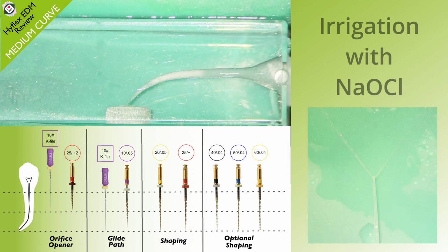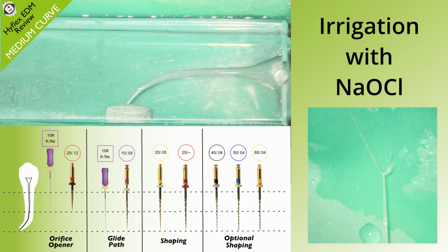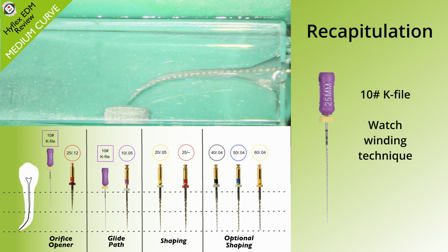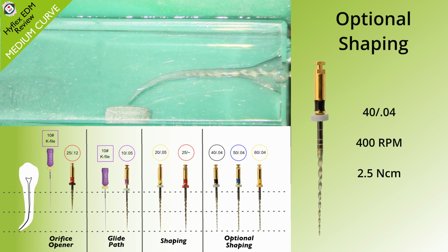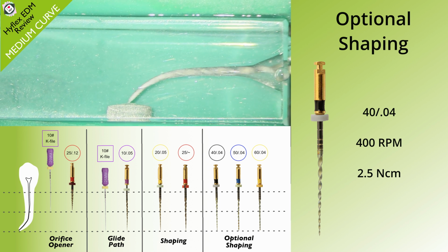So now we're ready to use the preparation file. And you know, it's making short work of this, and it's a really nice shape as well, as seen in the plastic block. Lots of debris, however. So again, irrigation. Those Hyflex tips, really getting all that debris out, and then recapitulation.